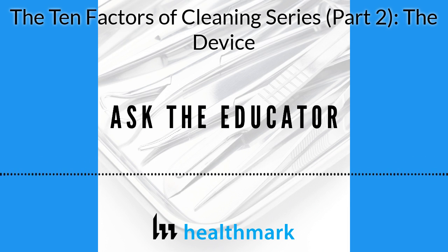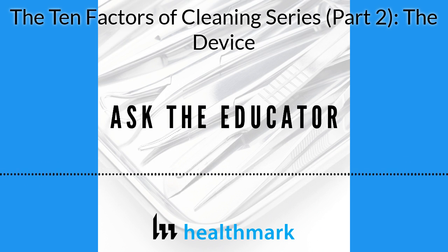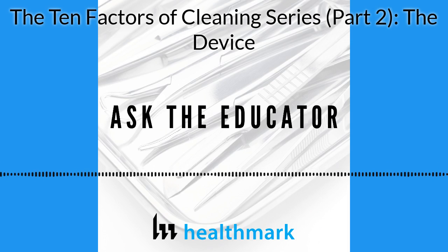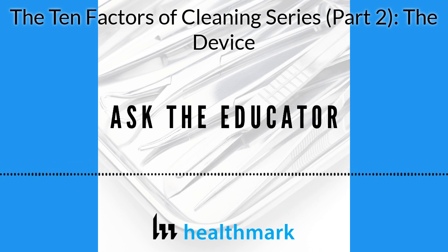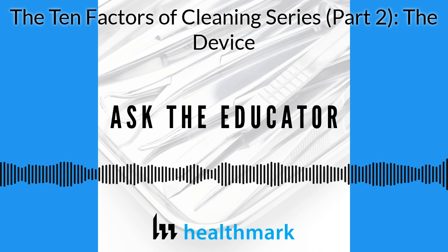You see how these factors sort of start to overlap, Kevin? Absolutely. And when you, as a manager, figure a problem out, you're doing a lot of these things. Did I train the staff? Or maybe somebody was off for a couple of months, and you talked about an orthopedic modular set. Maybe you had the in-service and they forgot to go read it, and they're in decontam and they didn't know it had to come apart or whatever. So they've got to understand the design of it and then put all those other pieces together. That's how I look at it. That's why I think design of the instrument is so important.